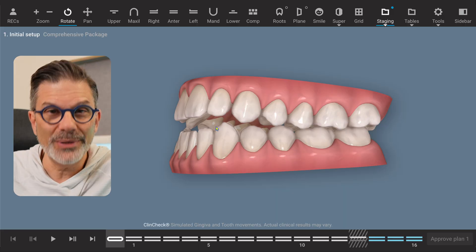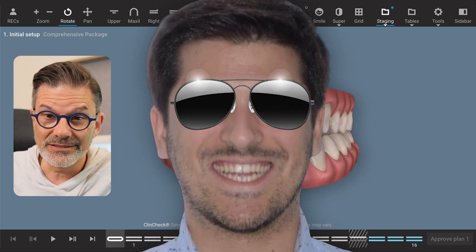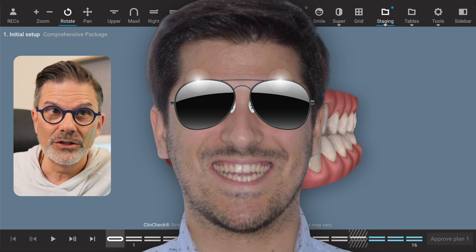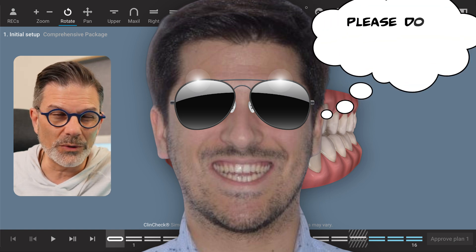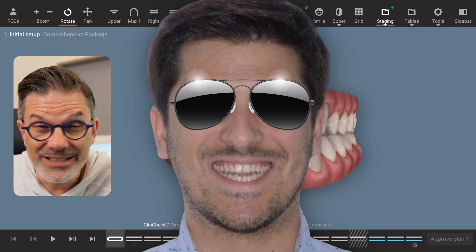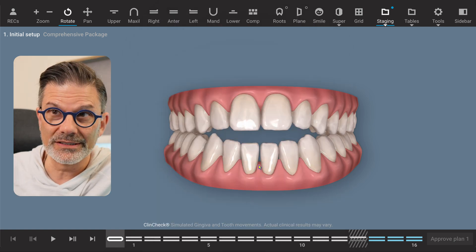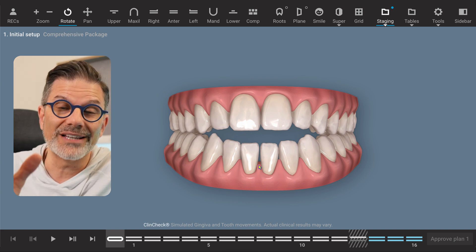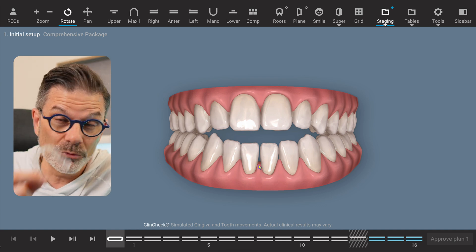For example, if you take pictures and you see that the patient with that anterior open bite already shows a gummy smile when they smile, what would be the purpose of extruding the anterior teeth? Increase the gummy smile? Maybe that's not a good idea. And we know that these vertical movements — pure translation movements like intrusion and extrusion — are among the most difficult movements to achieve with clear aligners, especially when they are pure and not relative.